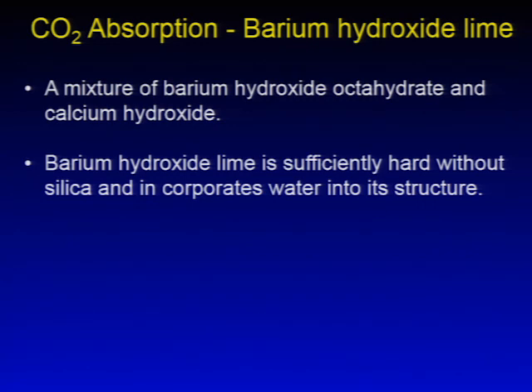I will explain that later. So baralyme is a mixture of barium hydroxide octahydrate and calcium hydroxide. The good news about baralyme is that it's sufficiently hard without adding silica, and it also contains water in its structure.